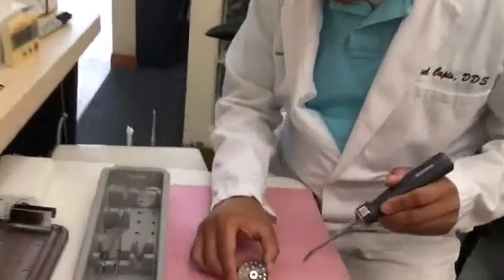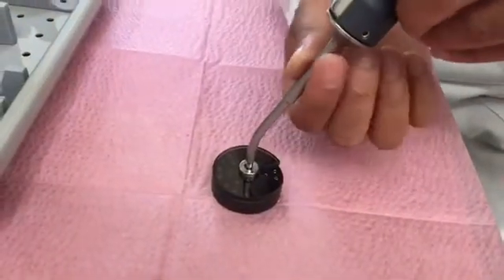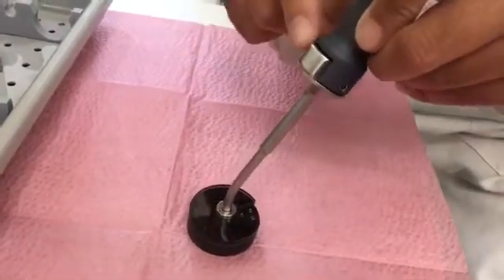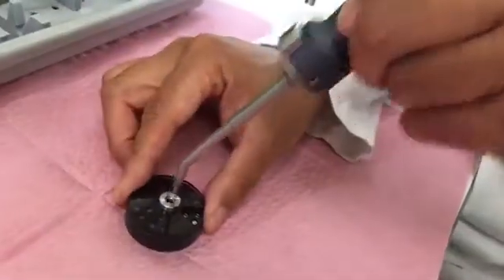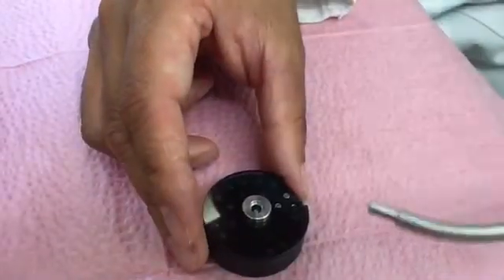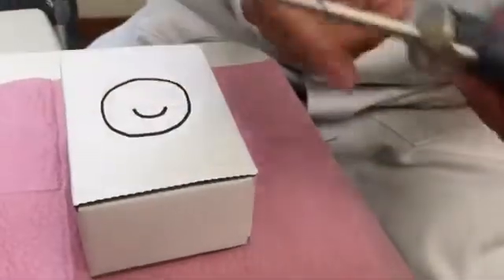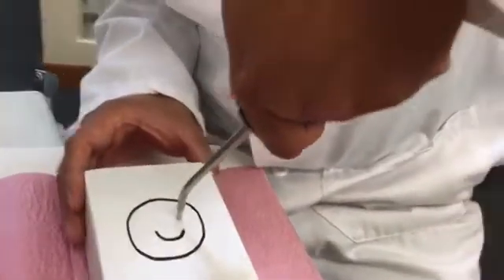I figured out that what you have to do is take this instrument here and activate it by pressing it. What happens is the button here comes up and becomes activated. Now, here you can pick up the tach, and then to place it, you press it.